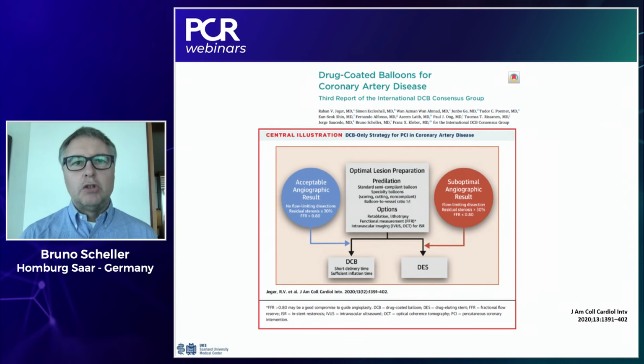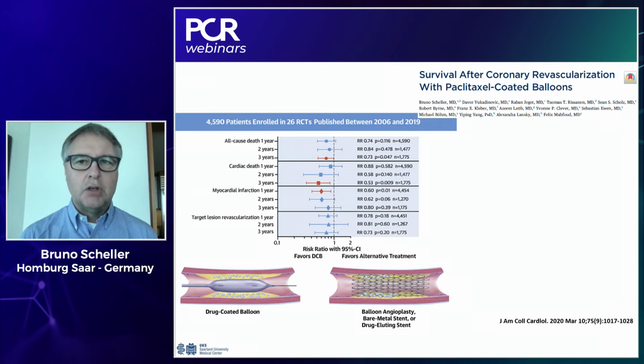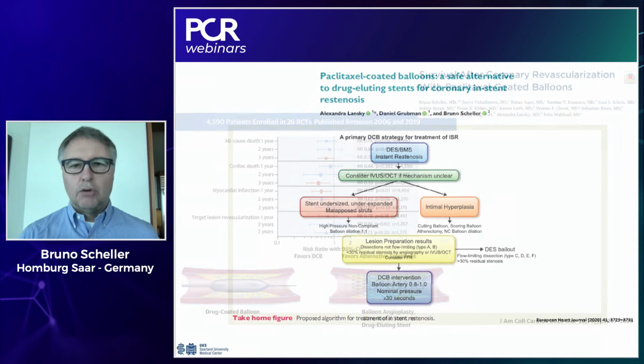What is the recommendation? How should we treat ISR lesions and de novo lesions with drug-coated balloons? The most important step of the procedure is not putting the balloon there, it is the lesion preparation. And you should do this as well as you can and as aggressively as you can to identify those lesions that can be well prepared and need only DCB treatment, and those lesions that require stenting with its additional radial strength and so on. And if you follow this concept of first lesion preparation and then decide what you do, then we have, meanwhile, very good data from randomized trials, from de novo and ISR treatment that show that you can reduce the risk of myocardial infarction within the first year. And maybe at longer follow-up, the stentless treatment may give you some advantages in long-term survival.